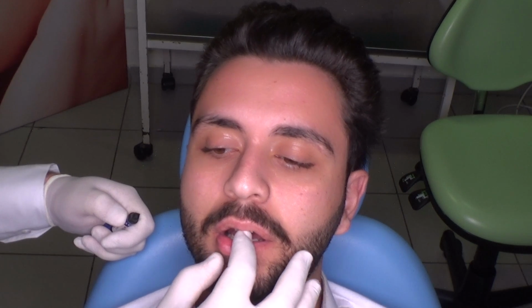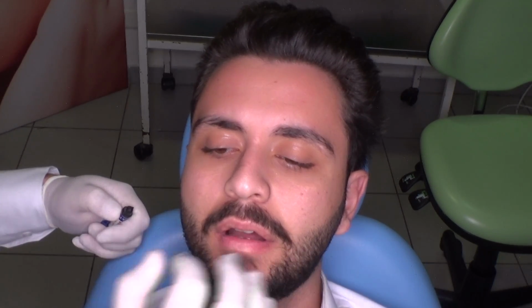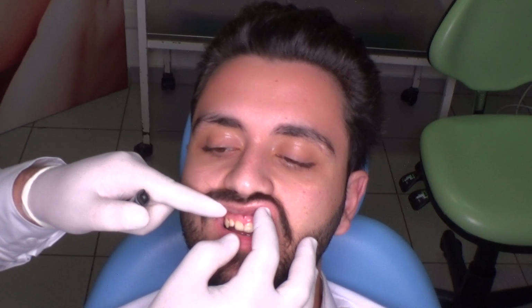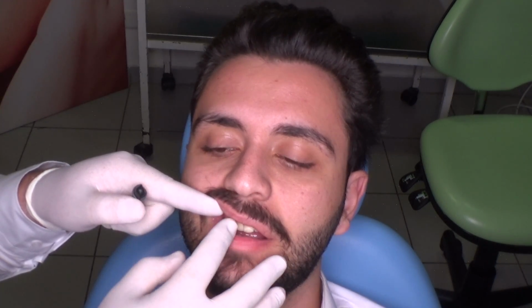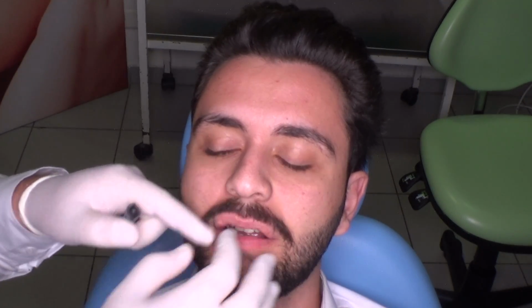As you see, in his case, in rest position, we slightly see the incisal edge position of his central incisor. So we can elongate just half a millimeter. In protrusion, we can add a little bit more to compensate the position of the laterals and the canines. So I take a simple composite, you see.